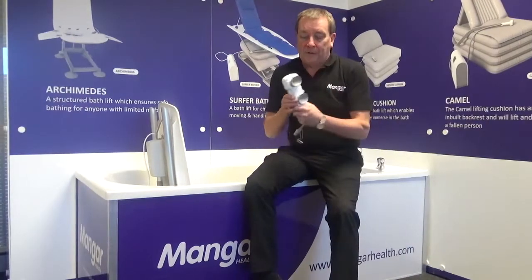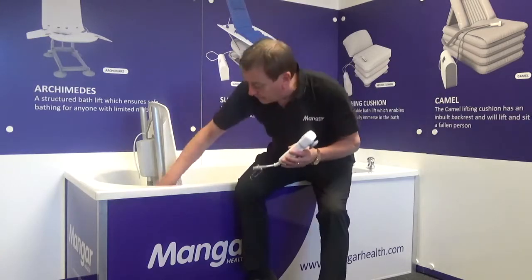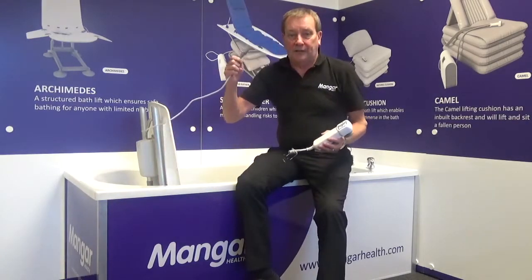Finally, with the handset, there are 2 big suckers on the back. So when it's not in use and I'm enjoying my bath, it can quite easily sit at the side out of the way. As far as connecting the handset is concerned, at the back of the actuator there is a lead.